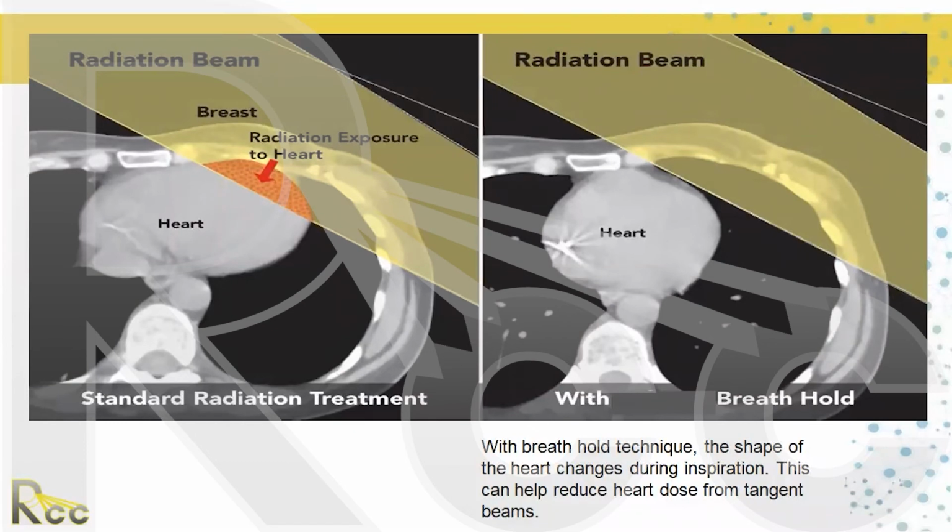There may be places that want to include it, but how you include it is going to be really difficult because of the treatment planning aspects of it. Don't forget, it's a large field. When you do a portal image, it's an image on an image technique, and there's always a large field. How do you model that large field on a computer planning system? You'd have to actually model a beam with a large field and include that in the treatment planning.